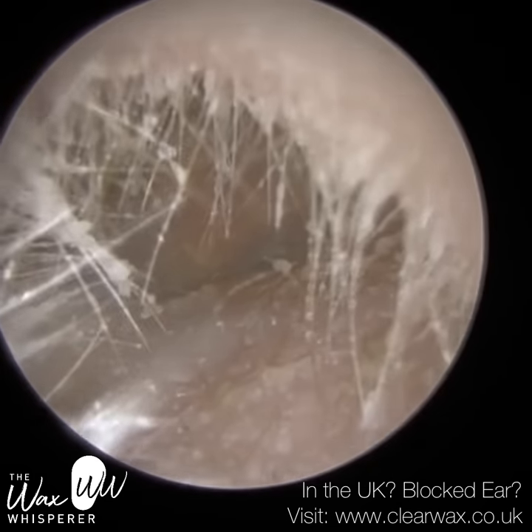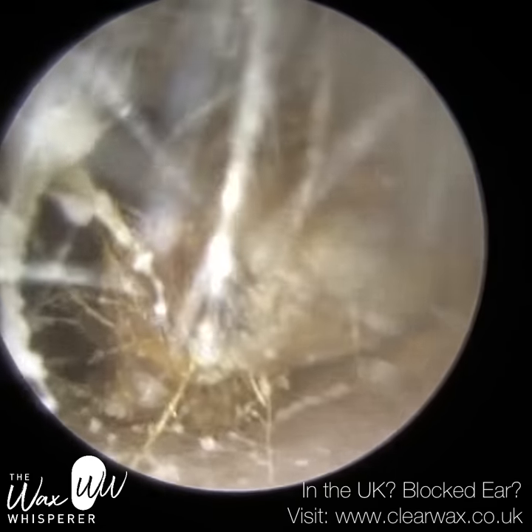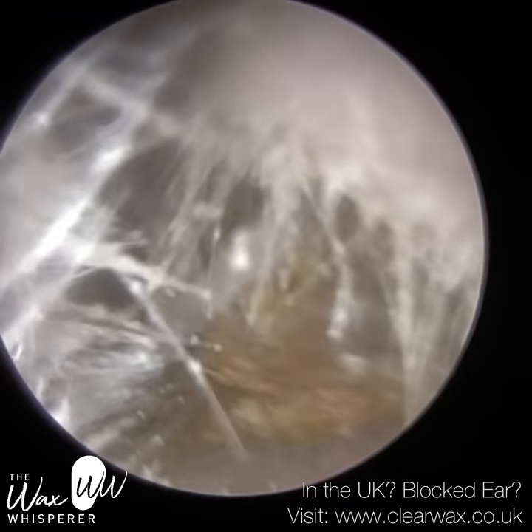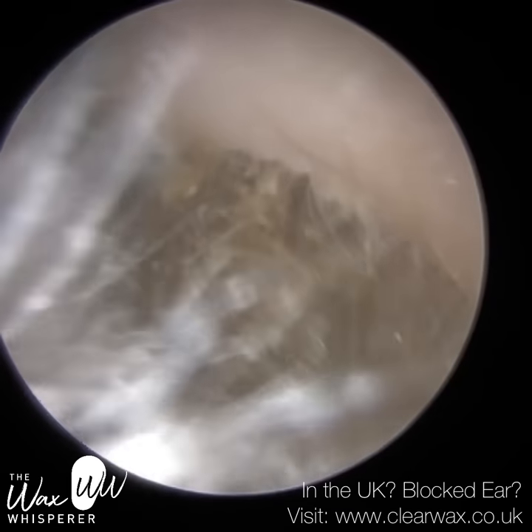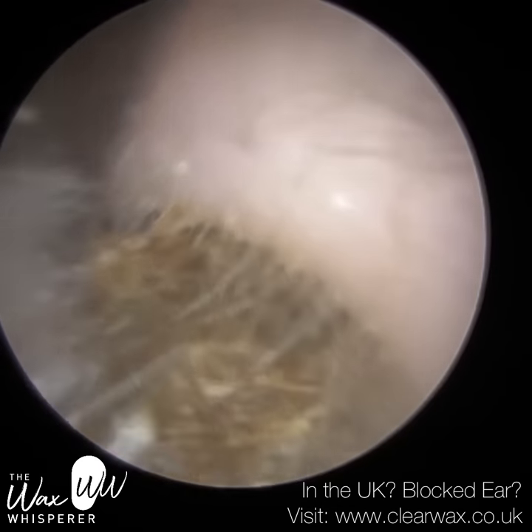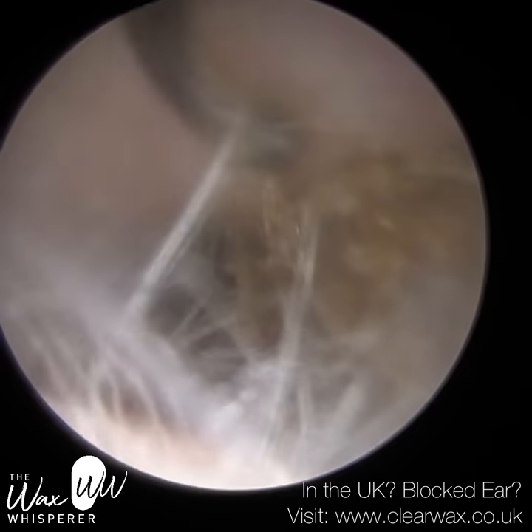We have here a patient who attended with bilateral reduced hearing due to lateral earwax plugs. When we say lateral, we mean towards the entrance, and in both ears the patient had this plug of earwax, but also dead skin — dead keratin that had failed to migrate out of the ear. In both instances, the removal of the earwax and dead skin plug was relatively straightforward. As you can see, I managed to hook it out.